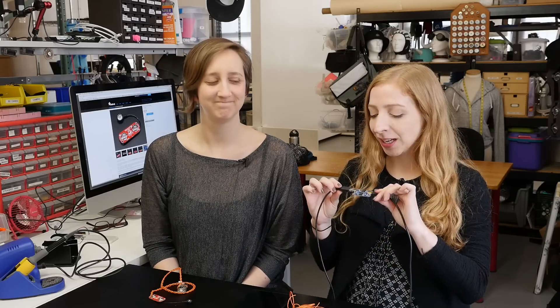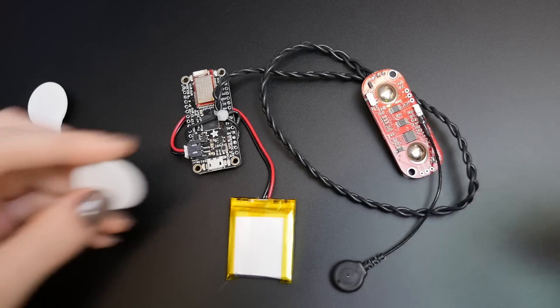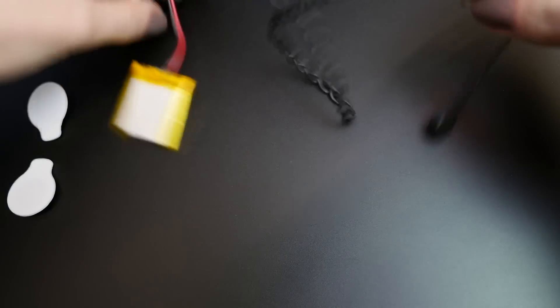Before we put the sensor on our muscles, let's talk about safety for a second. Anytime you hook up an electrical device to your body, you want to take the proper precautions. So if you're going to power this circuit over USB, you need to use a power isolator like this one. Once you're operating on battery power, the isolator's no longer necessary.